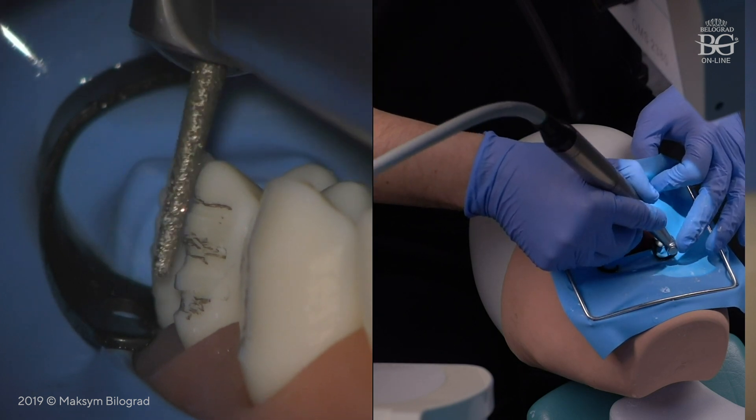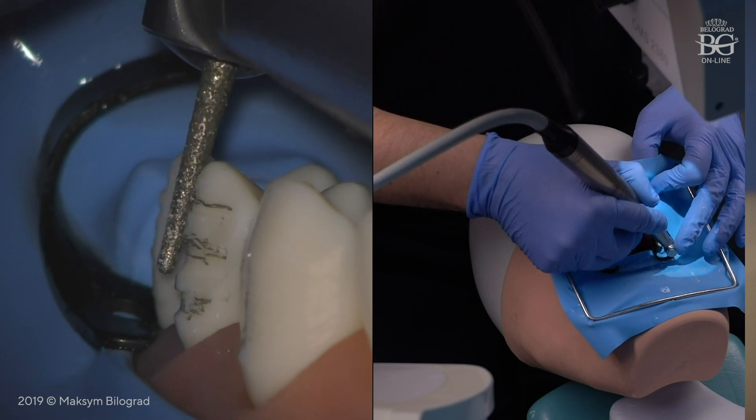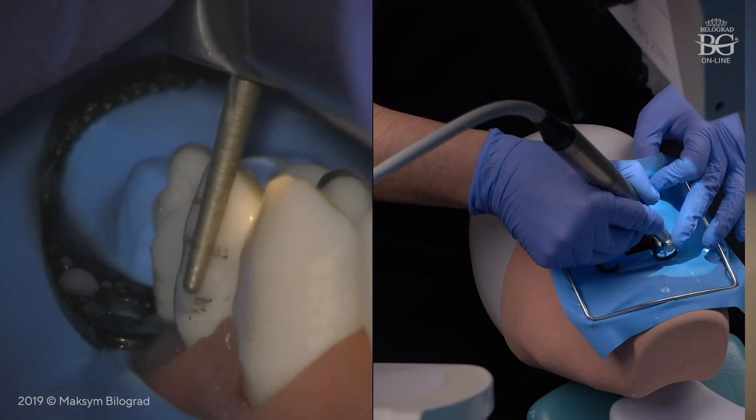The incisal plane is prepared by keeping the burr parallel to the incisal zone area. I would like to pay your attention to the fact that the tip of the burr is not working. I will prep this area until the marking line disappears.